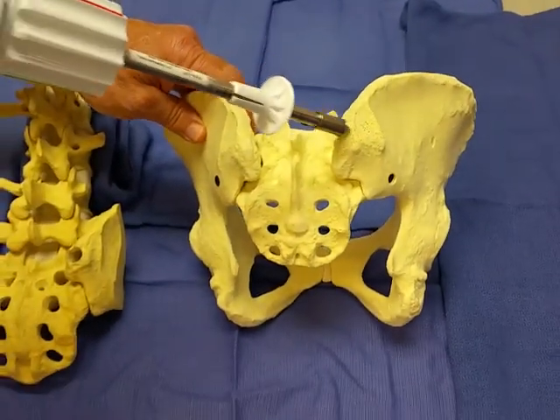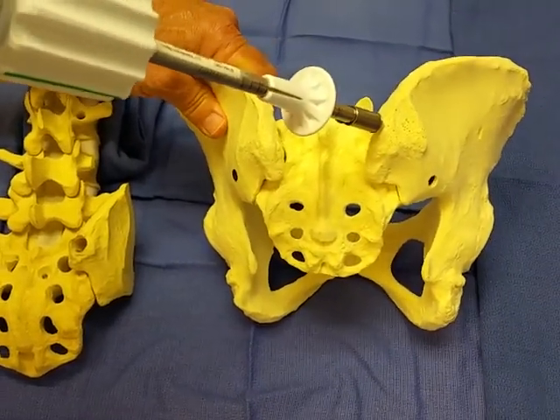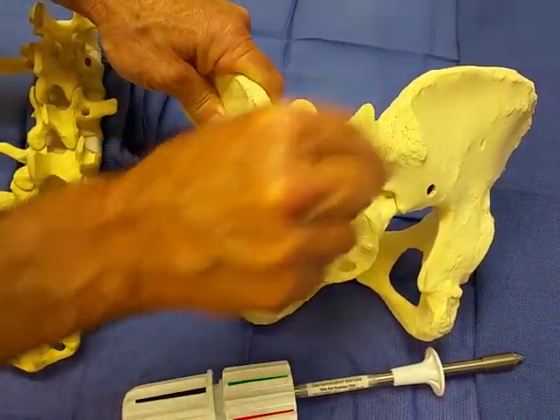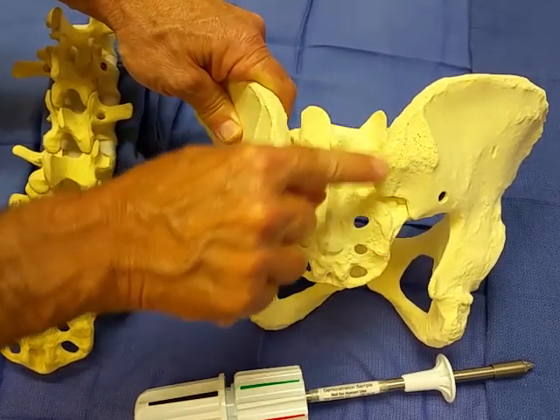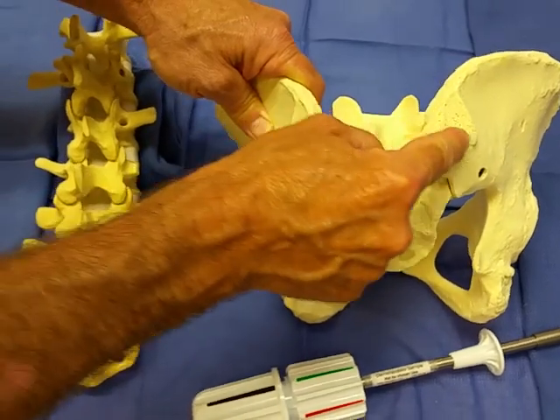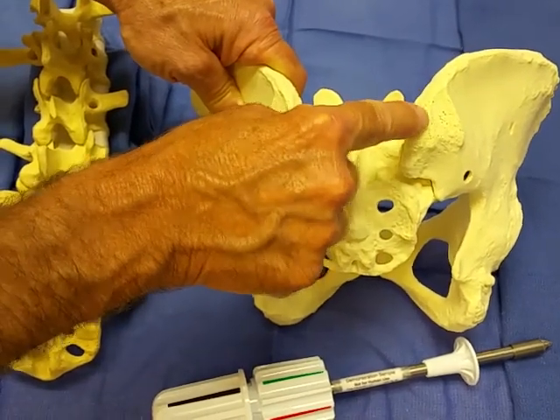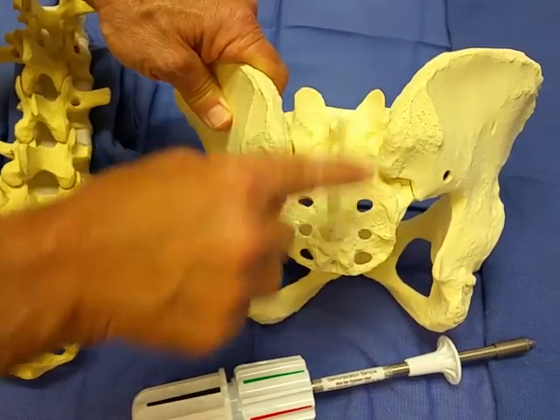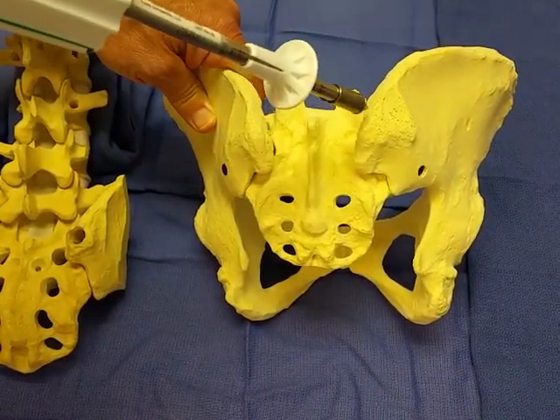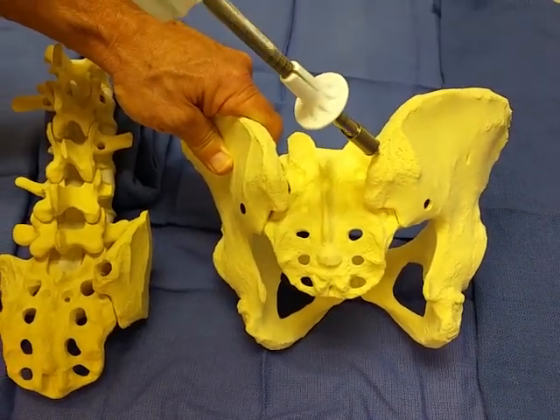After we place our trocar tip through the skin incision — and it can be done percutaneously — I would use a hemostat to rake the soft tissue, basically the subcutaneous fat, and feel the surface by running it in a medial to lateral and lateral to medial direction to get a good sense for where the most posterior surface of the posterior superior iliac spine is. Then once you've envisioned the proper trajectory and location, you would locate the trocar tip on.